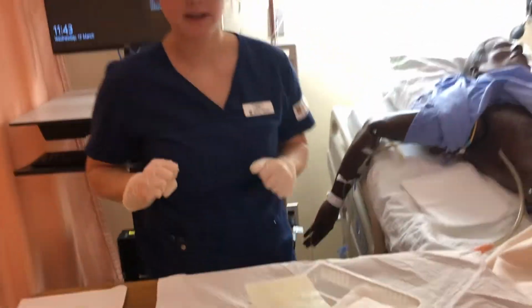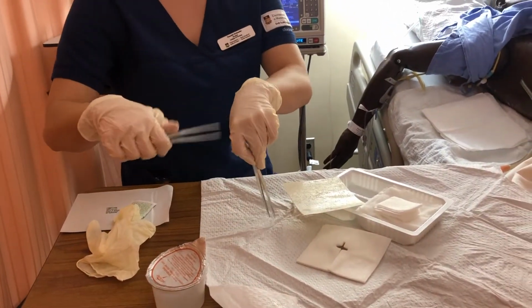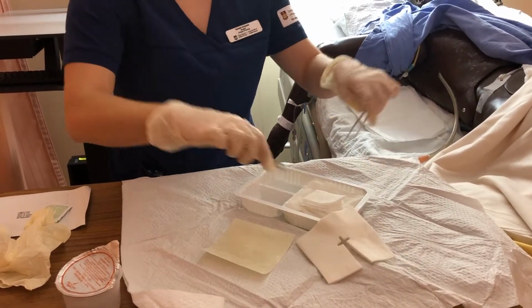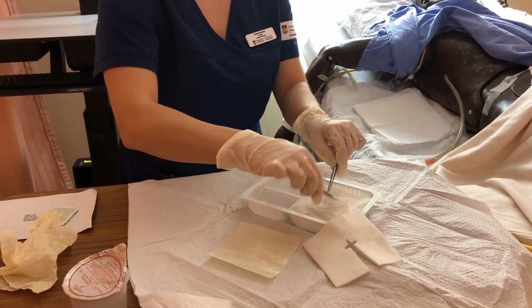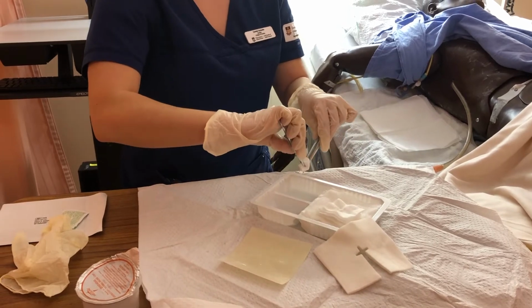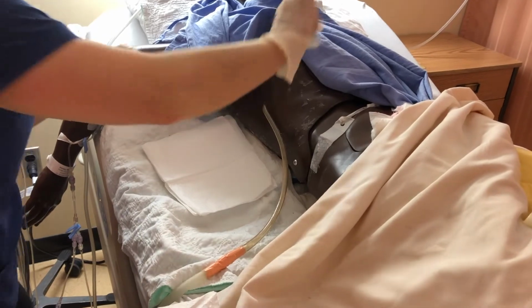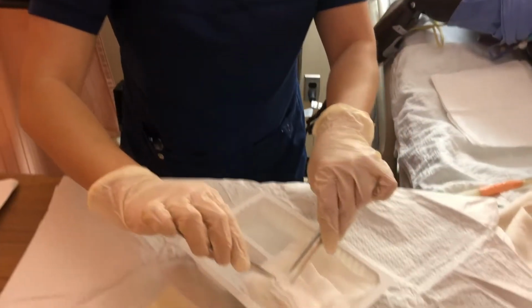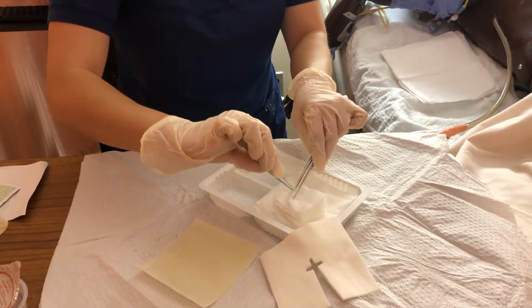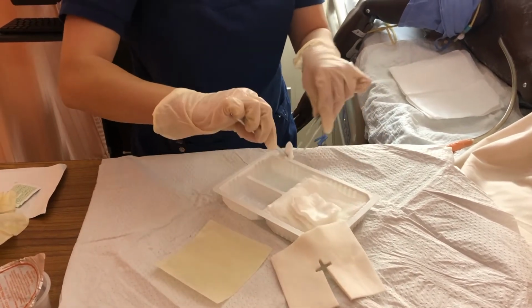So now I'm going to clean my site after assessing it with some 2x2s and normal saline. I'm just going to move this over. Let's squeeze that. Going in just circles around the drain, one swipe per wipe. I might even use a 4x4 to cover a bigger surface area, but to get closer to the tube, I'm just going to use the 2x2s.